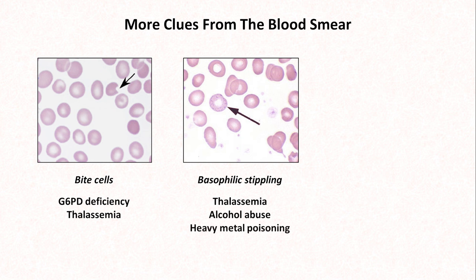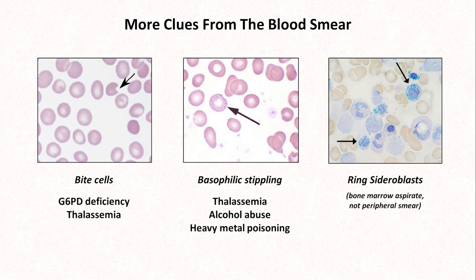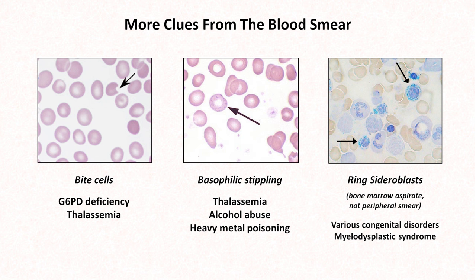Last is a finding not seen on a peripheral smear, but rather on a bone marrow aspirate. These are ring sideroblasts, which are immature nucleus-containing red blood cell precursors in which iron-containing granules surround the nucleus. This is seen in various congenital disorders, myelodysplastic syndrome, the use of the antituberculosis drug isoniazid — which can lead to a functional deficiency of vitamin B6 — alcohol abuse, and copper deficiency.